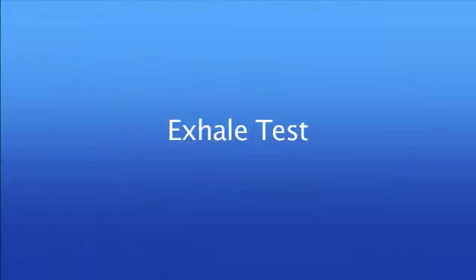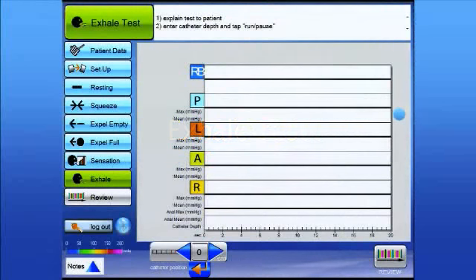The last of the 6 standard protocol tests is called the exhale test. And the exhale test is asking the patient to expel a simulated bowel movement while blowing into a party balloon. You may ask the patient to simply exhale their breath, or the patient could simulate a cough. But the best results can be achieved with exhalation into a party balloon.